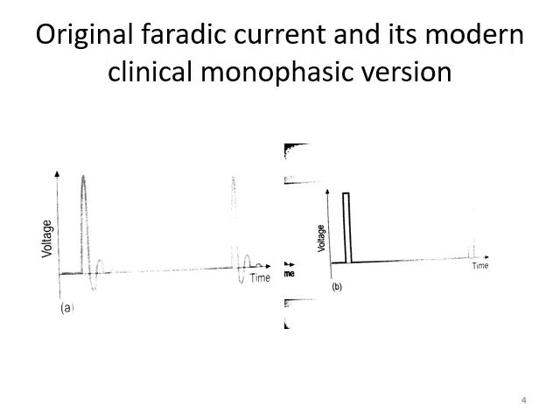The modern stimulators modify this pulse, and they have made a sudden rising, very short duration rectangular pulse, and that's why this monophasic pulse producing instruments are known as Faradic type stimulators.